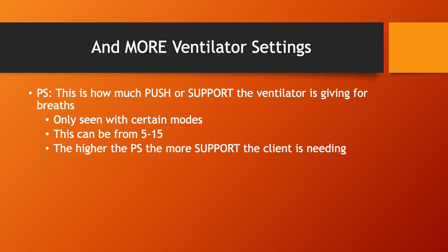And so then if my patient's pressure support is 10 or 12 or 15, things like that, that means that patient might still be needing that ventilatory support. They may still need a little too much where they might not be ready to wean. So really we're just looking at those settings. And we're going to talk more about the pressure support when we get to that mode.